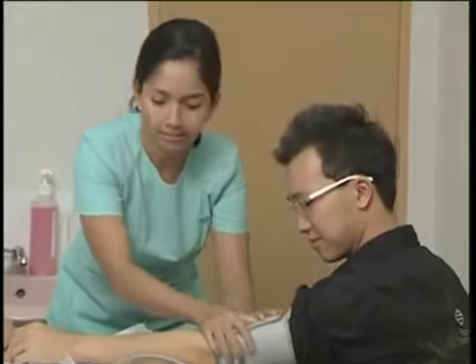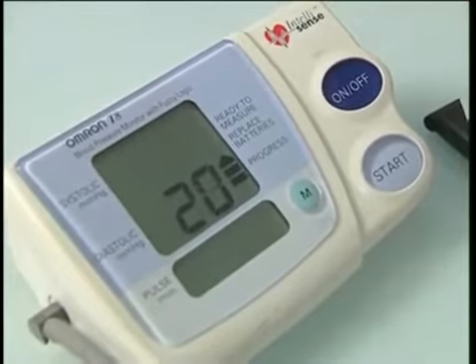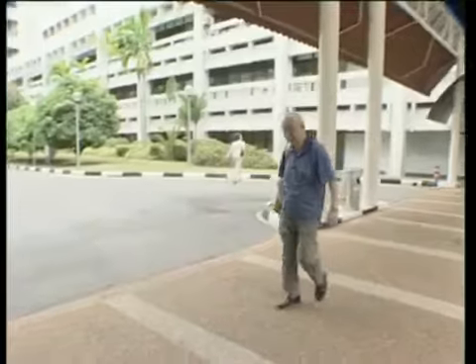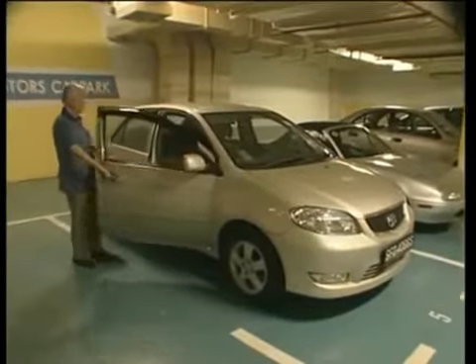When we look at a person who's young and you measure the blood pressure at the brachial artery, you actually find that the brachial pressure is very different and significantly higher than the central pressure. It can be as big as 30 millimeters of mercury. But when we grow older, the brachial pressure and the central pressure come closer. That also means that the vessels get stiffer.